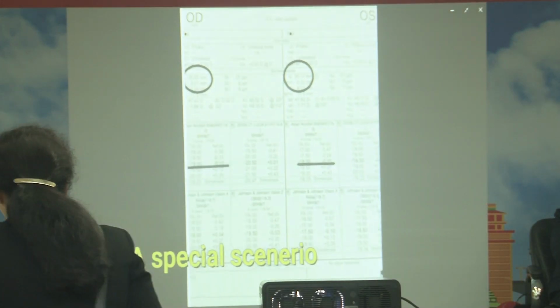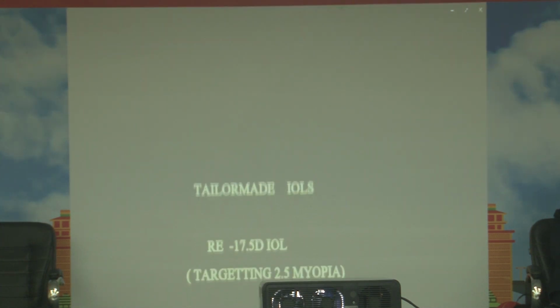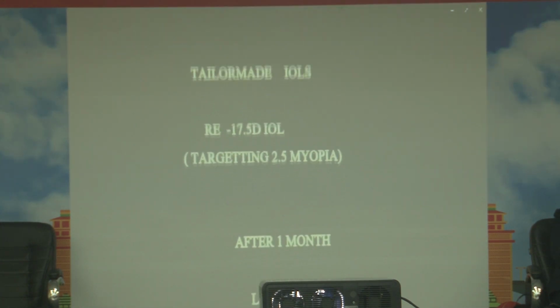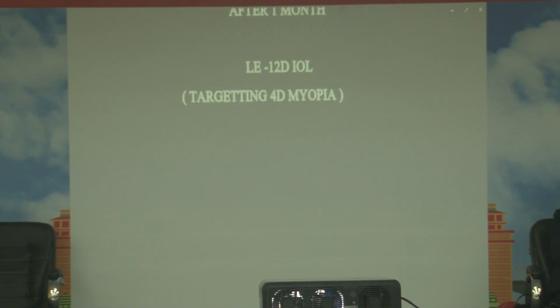It is a very happy procedure. Sometimes you have a special scenario like this, where you have very high myopics with IOLs which have to be tailor-made, a myopic IOL, and you never know what you're exactly inserting, what you're actually going to do, but then you have to do it.